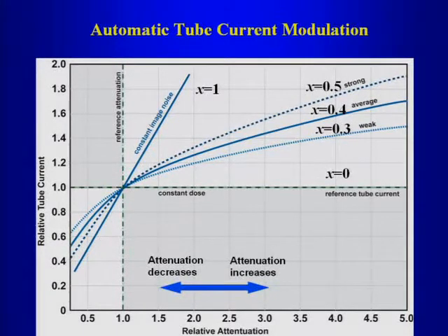Actually, in diagnostic CT, this strategy is unnecessary. This is because when the patient size is bigger than a standard size patient, their structure is bigger and there is an inherently higher contrast. So the noise can be allowed to be higher than in a standard size patient.